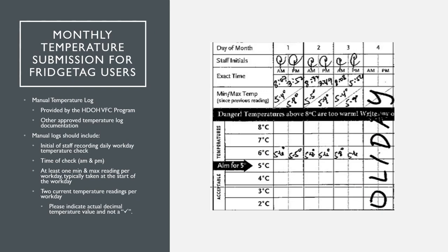We do want to note that we know that our temperature logs say that you should put an X in the box where the manual or the current temperatures go, but we have now changed that directive to have our providers write the actual temperature there.